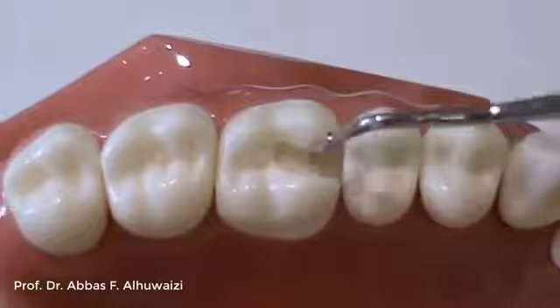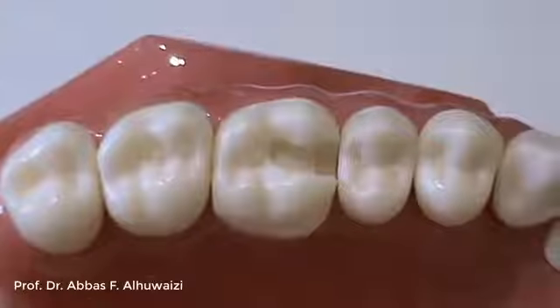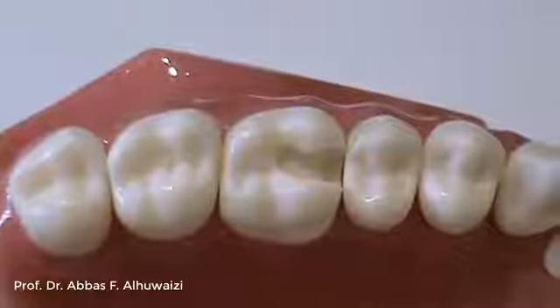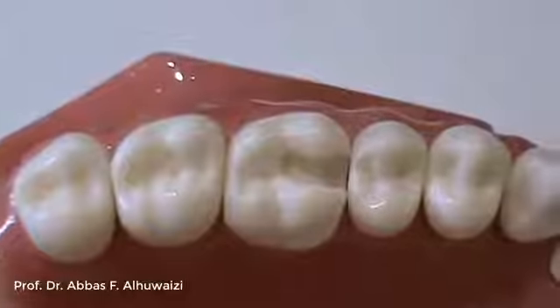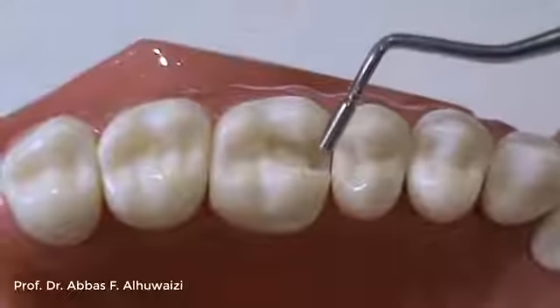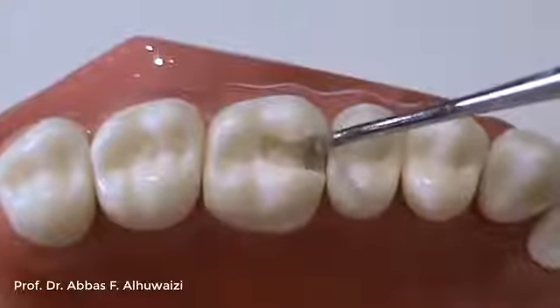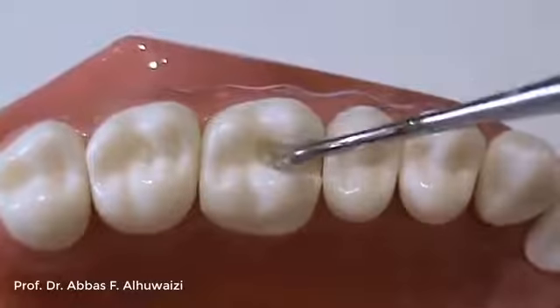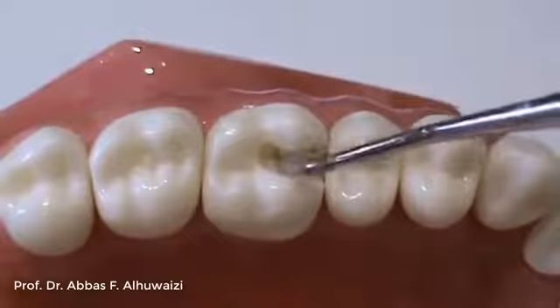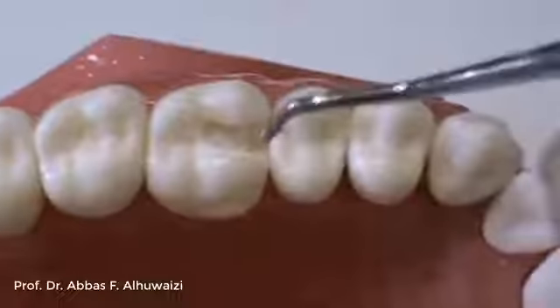The convenience form is checked by holding the condenser. The smallest side of the condenser should fit nicely into the cavity, both the box and the Class 1 portion of the cavity, to ensure good condensation of the cement and the amalgam in the cavity.